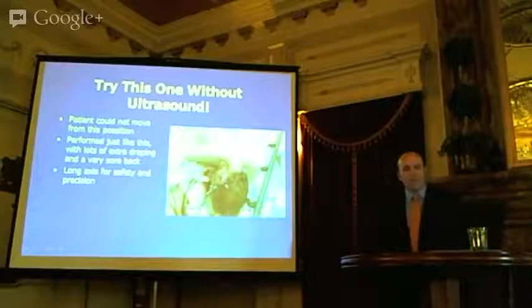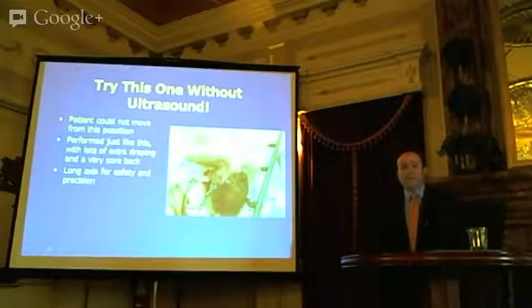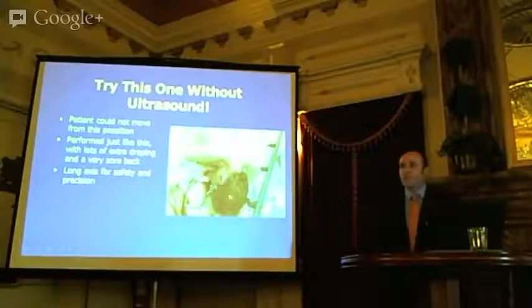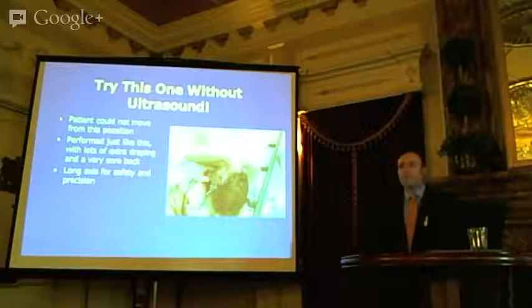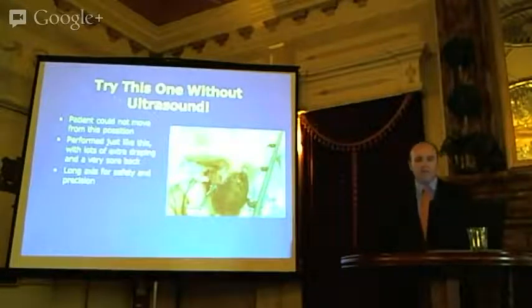Not the previous picture, but I got called up to my ICU by the director. They needed access, but this is the position she had to stay in because of multiple neurological problems. So I actually never looked for landmarks. I just put an ultrasound probe on, prepped her and everything. And this kind of looks suspicious, like it's coming out behind the ear. I didn't realize that until after I pulled the drapes off. But the reality is on ultrasound, I knew what was between the skin and my target. I could guide my needle there. And you'll quickly realize if you can see it, you can stick a needle into it. And it was done safely, and she now had access.